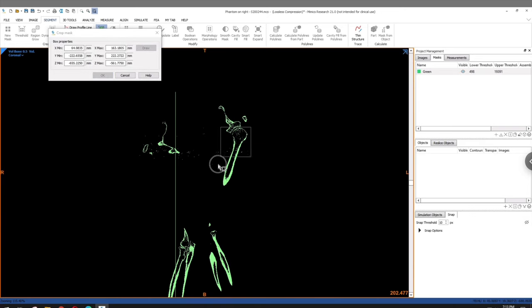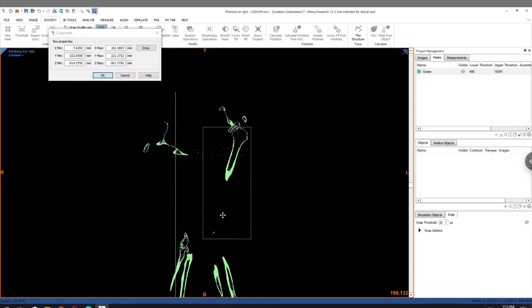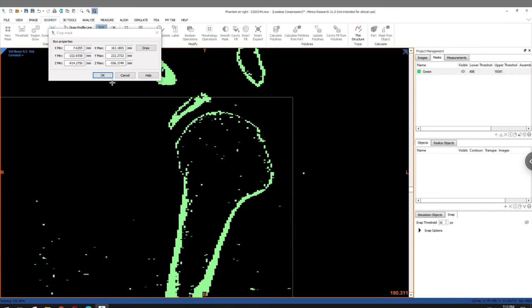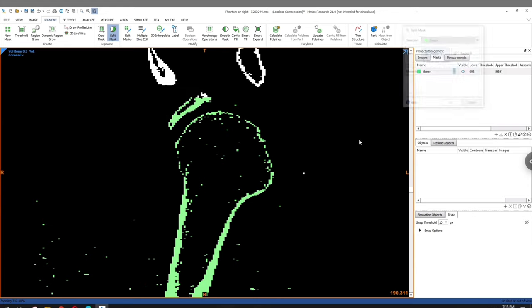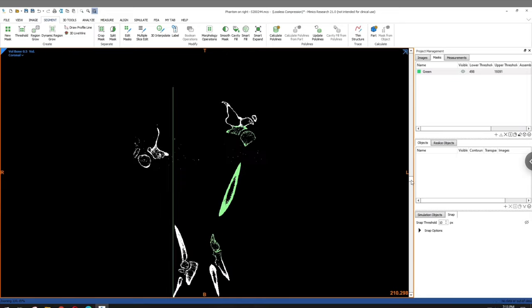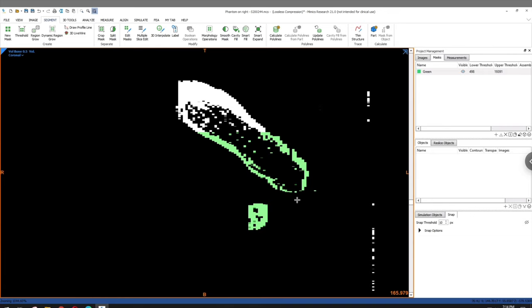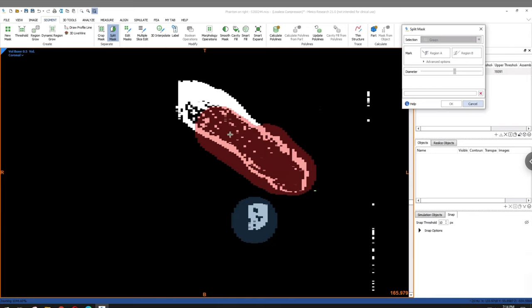And after you complete at least your primary rendition of your mask, I would very much suggest that you crop your mask to just the local area that you're going to be working with for the course of your study, as some features in Mimics itself are either very slow or will not function at all if you're still working with a global mask. So as you can see here, I just really quickly crop the mask, and now I'm going to use the split mask feature in order to really isolate my humerus.